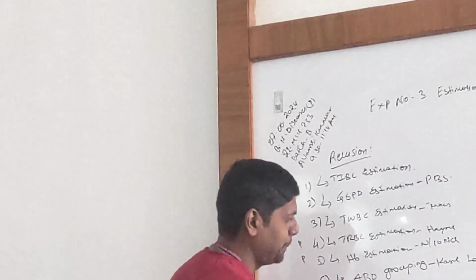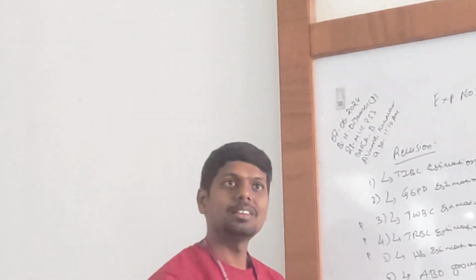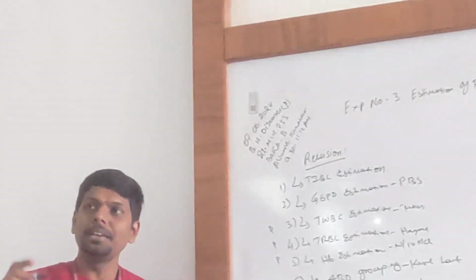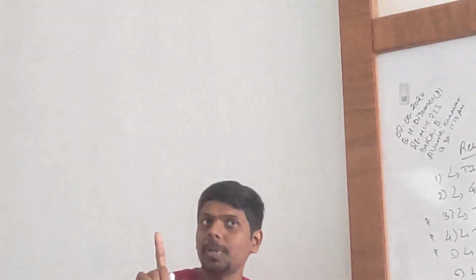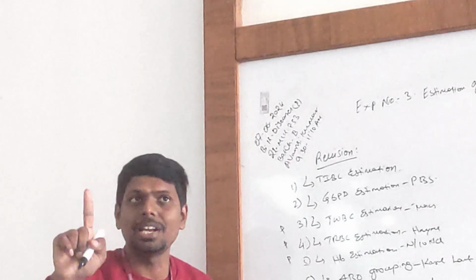You know what blood typing means? That is a separate test. Any idea? Okay, the blood type is either positive or negative. Blood typing will be done. Typing is different from grouping, keep in mind. Typing was determined by another scientist. It is not Carl Landsteiner.